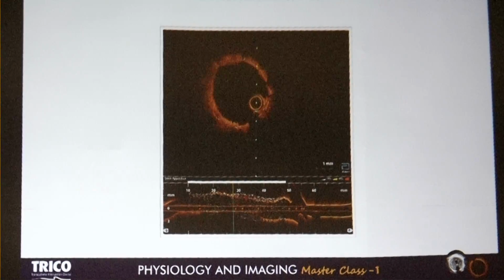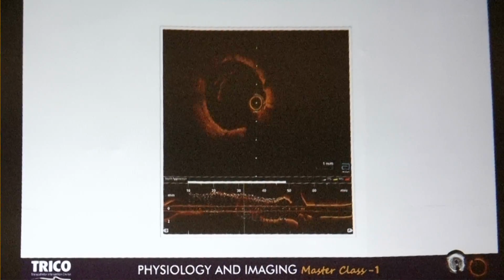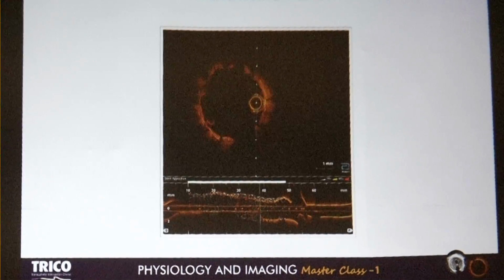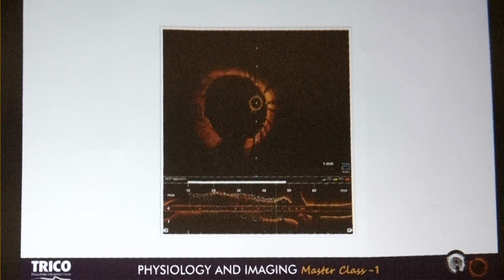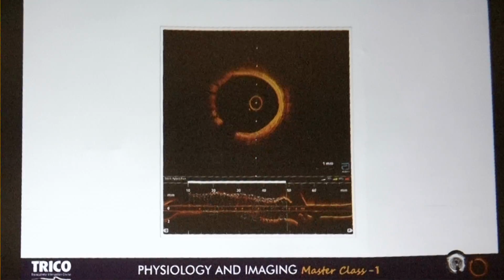That's your MSA right there, right? Yep. So now that ugly looking area, in that area we are moving. It doesn't look all that bad in this region now, and with a good MSA. So any comment on this?